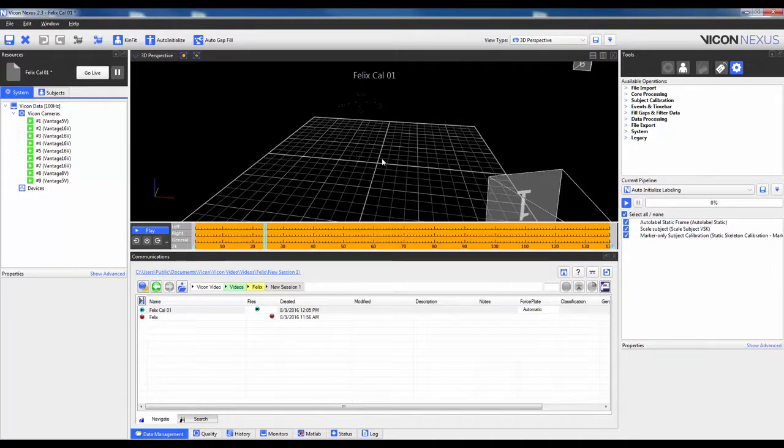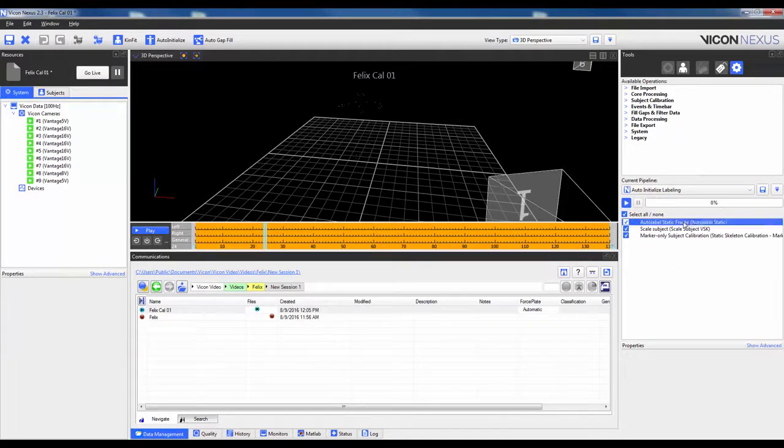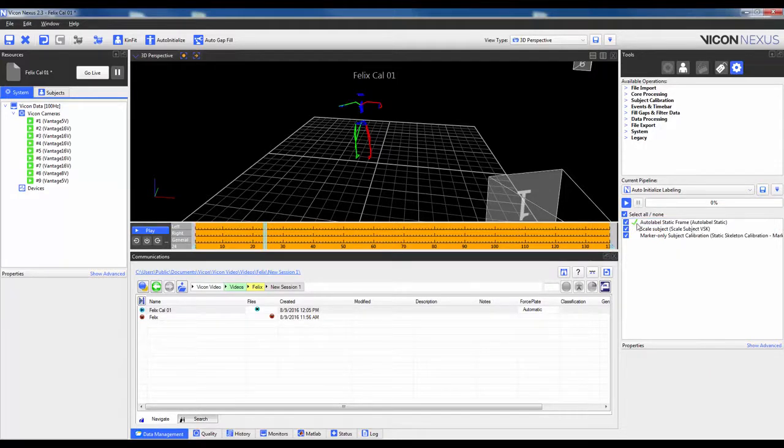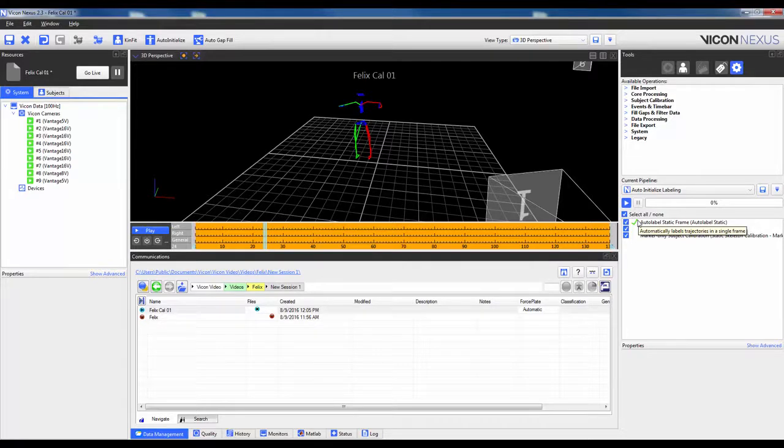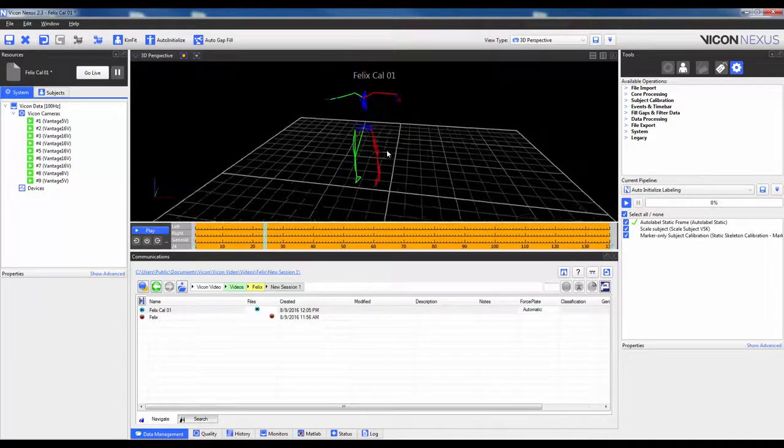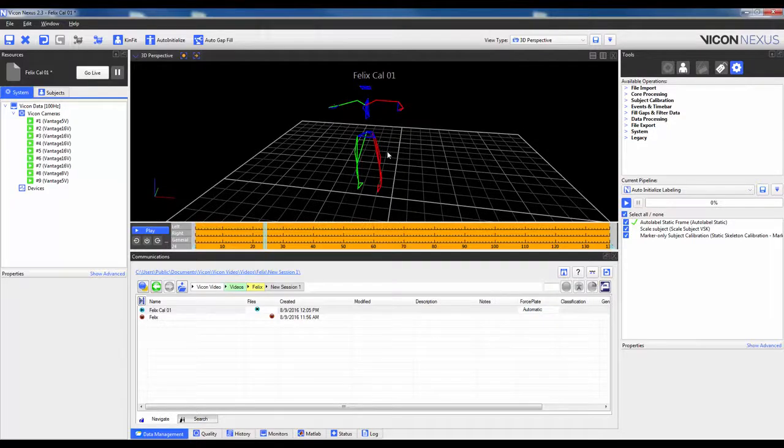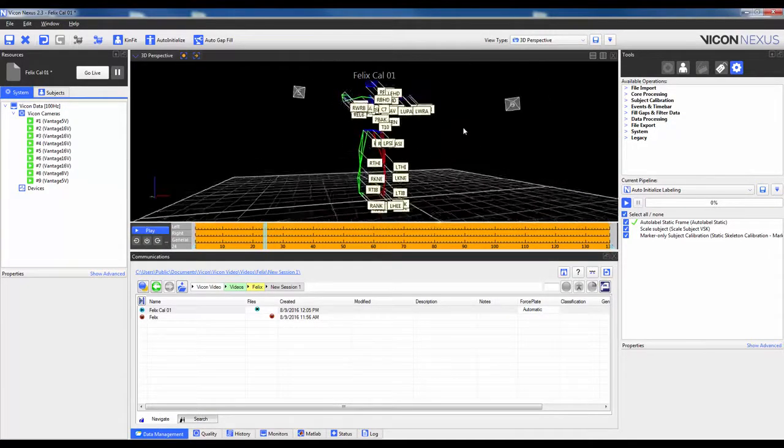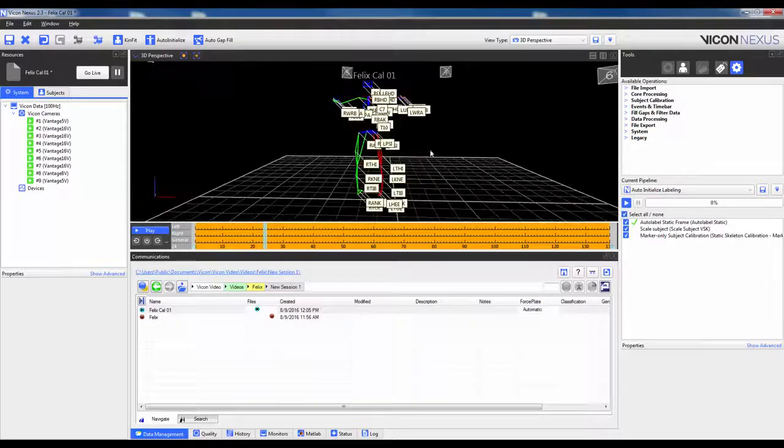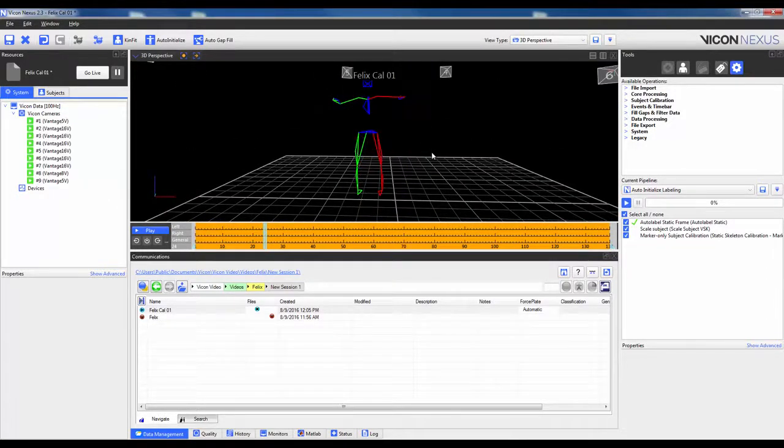You can always change the current frame and run this pipeline on a different one. To run this pipeline operation individually, I will right-click on it and select Run Selected Up. The green checkmark indicates that this pipeline operation was successful. If it was not, let's say due to a missing marker as an example, you would get a red X. To quickly check the labels before proceeding, use the hotkey of the control button plus the space bar, so I can navigate around and actually look at my markers. I will then hit Control Space again to get rid of the labels.